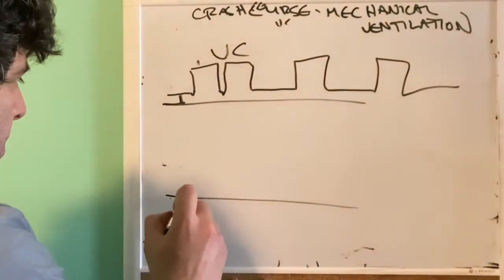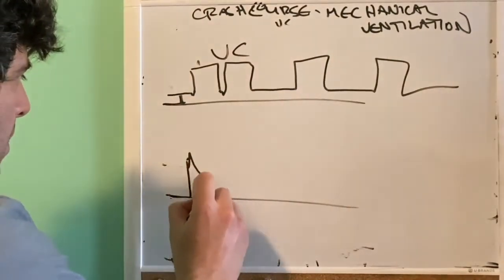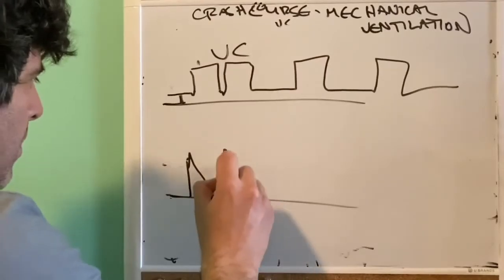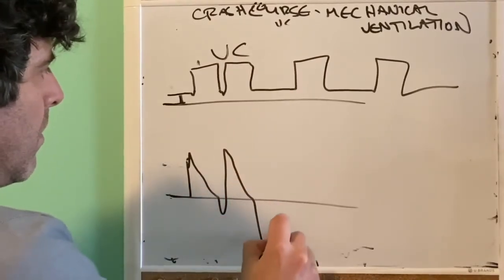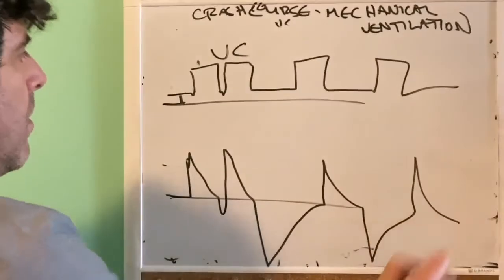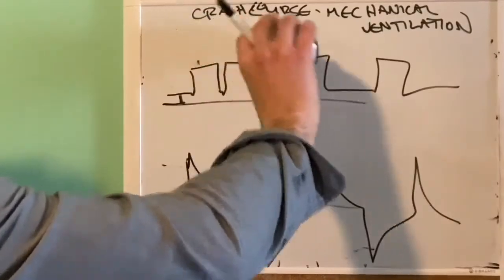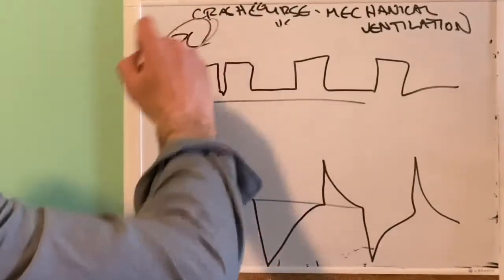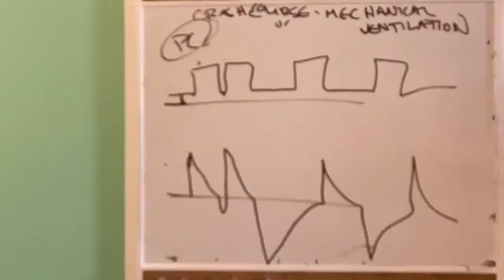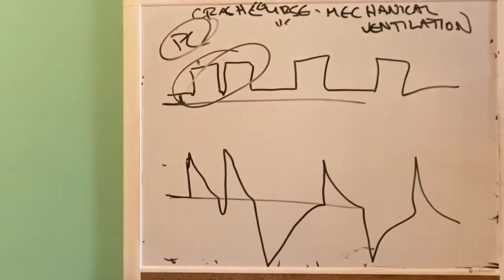And what often this will look like is, all right? And if I ask you, this is pressure control now, what's abnormal about this? Now, if you know the normal scalars, you should be able to look at this and say, this is abnormal. So then think, what is going on here?